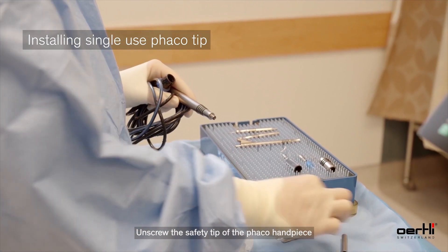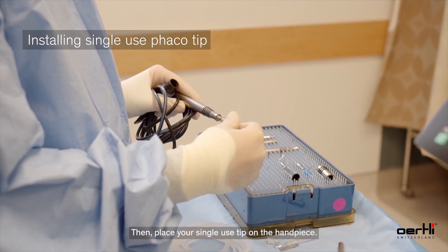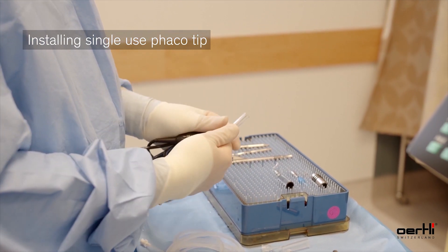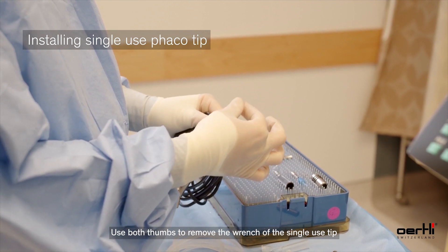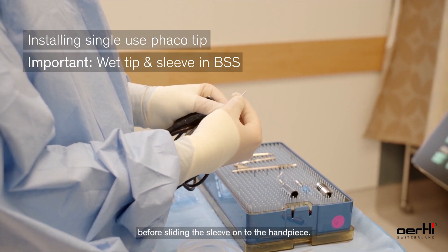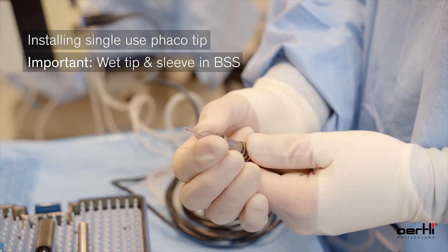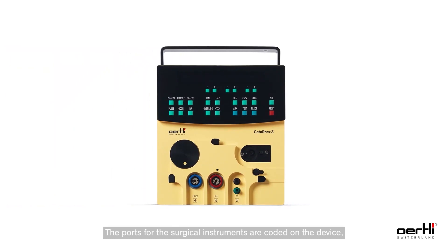Unscrew the safety tip of the FACO handpiece, then place your single-use tip on the handpiece, ensuring that it is tightly secured. Use both thumbs to remove the wrench of the single-use tip. Ensure that your sleeve is dipped in BSS and wet before sliding the sleeve onto the handpiece.